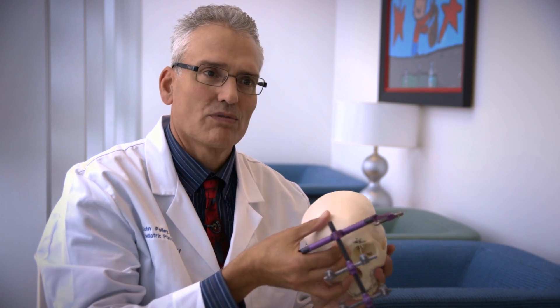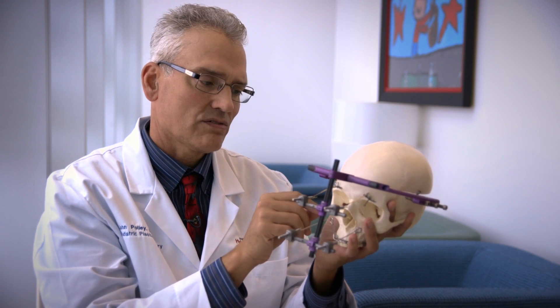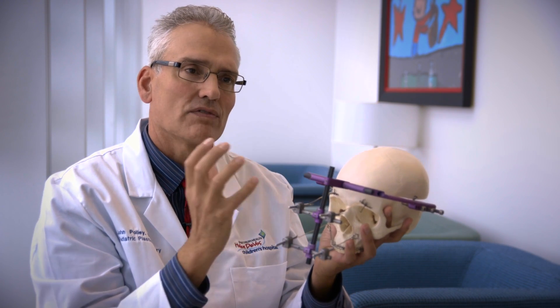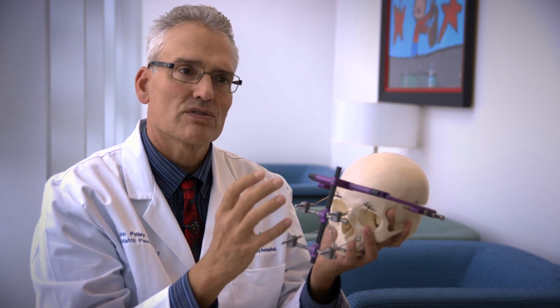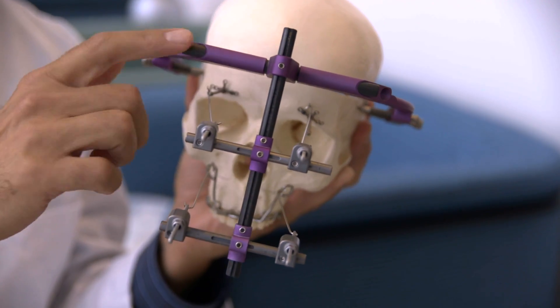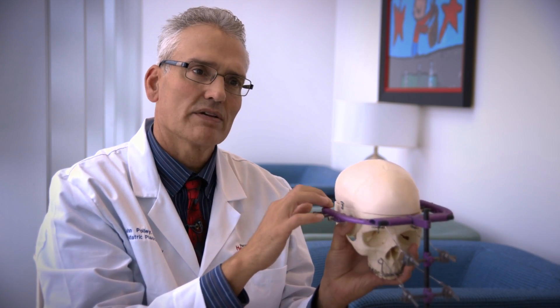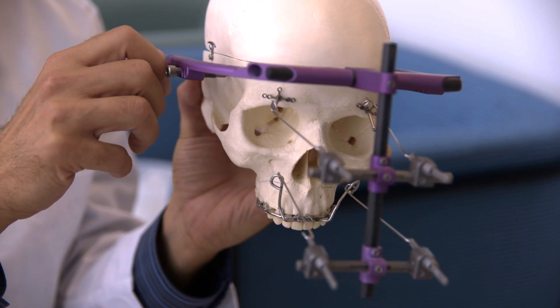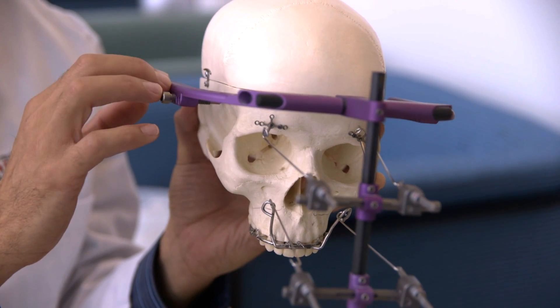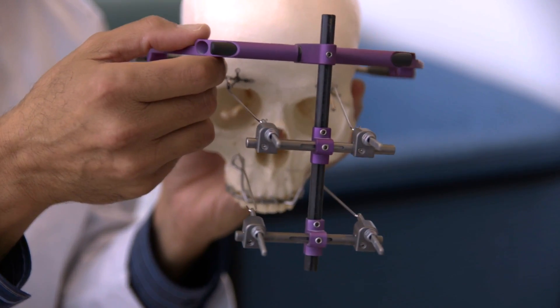This is a pretty good-looking contraption, but let's show you how it works. If we need to move the whole face forward, using just an internal device on one side is pretty hard to do — we want good control over the entire facial skeleton. So we use what we call a halo device, also known as a RED device, which stands for Rigid External Distraction. The halo is attached to the cranium by scalp pins — these pins do not go into the bone; they just push on the scalp and rest on top of the bone. When we put these in on both sides, that anchors the halo in place and gives it a lot of strength so it won't move.